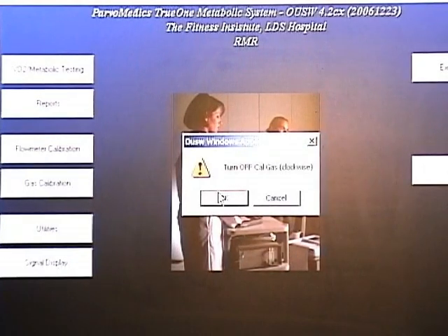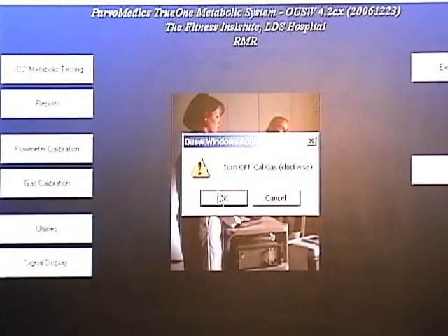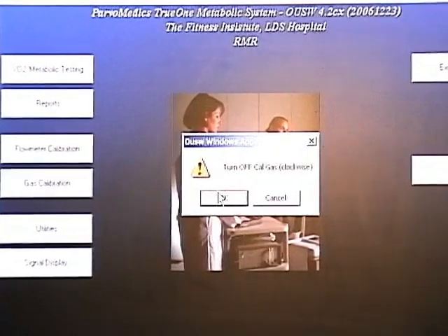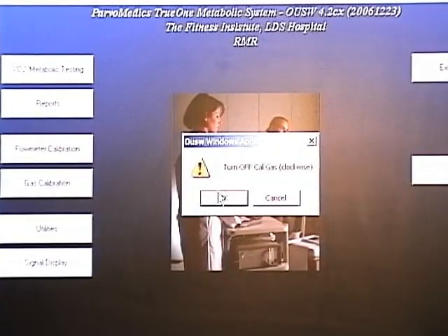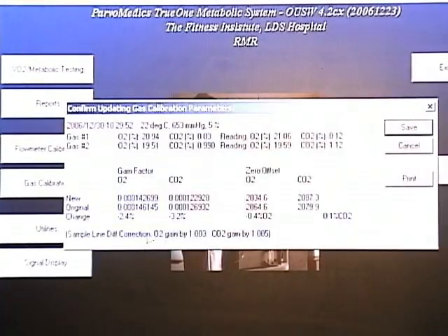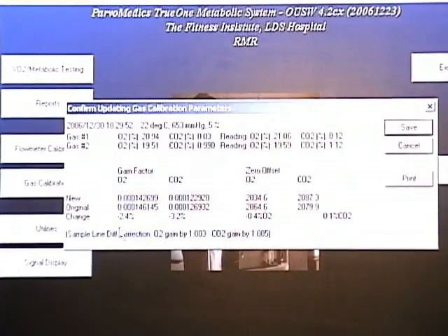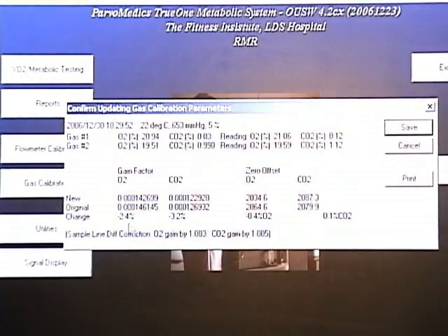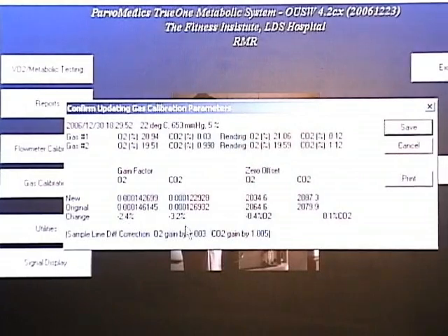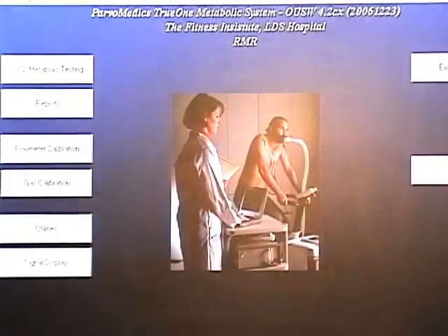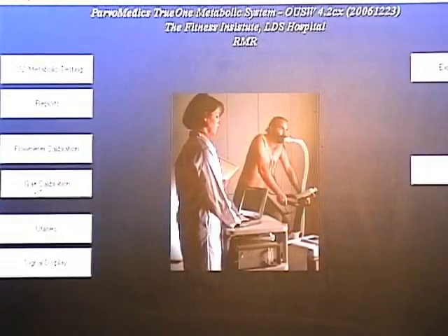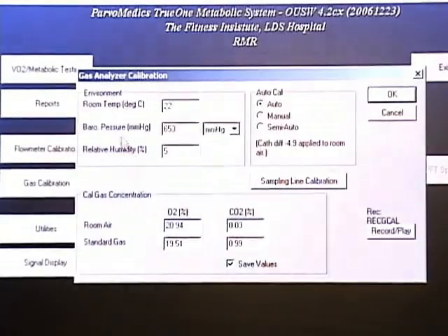Prompt us to turn off the cal gas. O2 changed by 2.4%, CO2 changed to 3.2%, save it, and then let's redo that again.